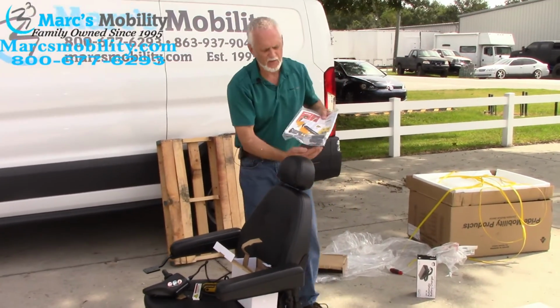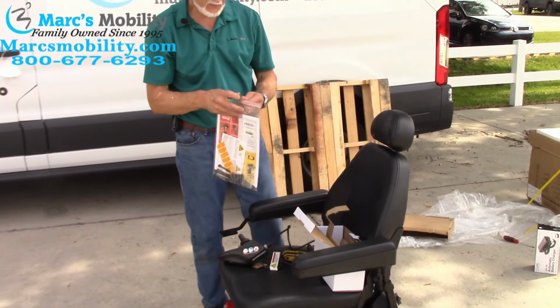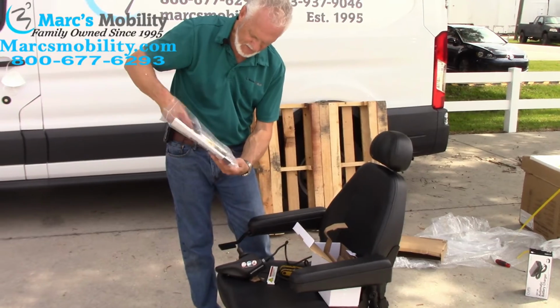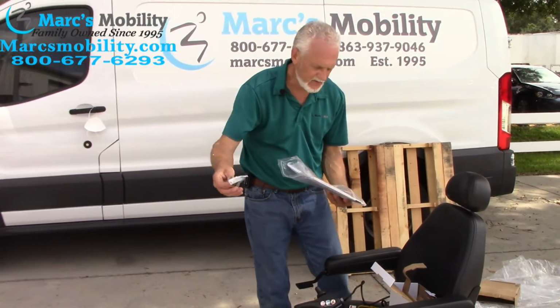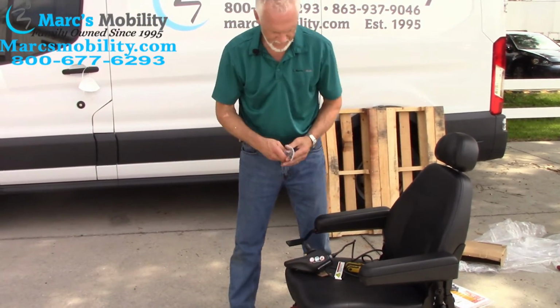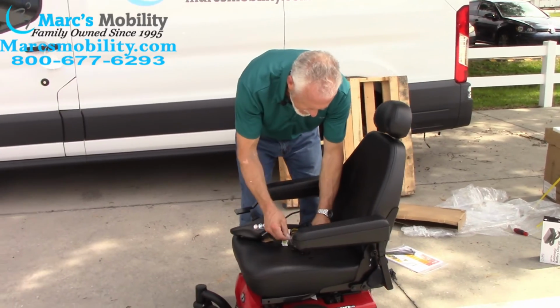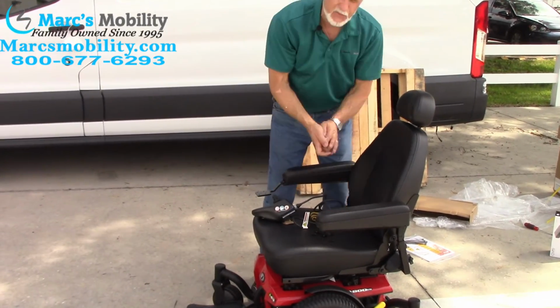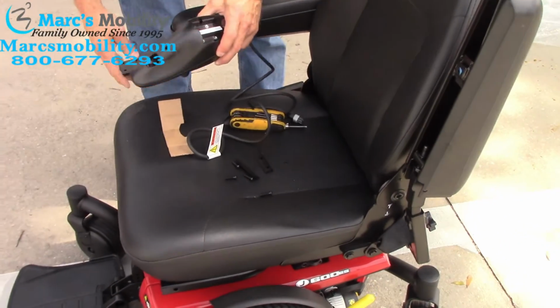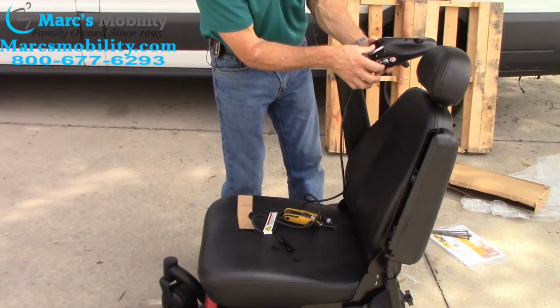In your owner's manual, there's 4 screws in the bottom right here. You're going to take those 4 screws out and 2 little tabs. So here's the bag with the 4 screws and the 2 tabs. So what you're going to do, you're going to get rid of this box. You're going to open this bag, put your screws on the seat. You'll have 4 screws and 2 plastic tabs, if you can see that from over there. Okay? You're going to put your tabs inside of here, like this.